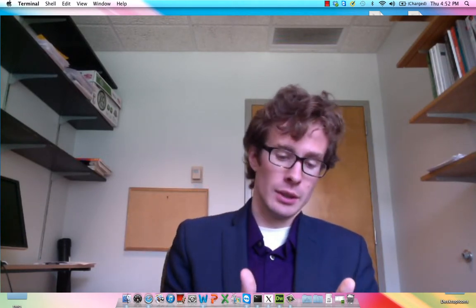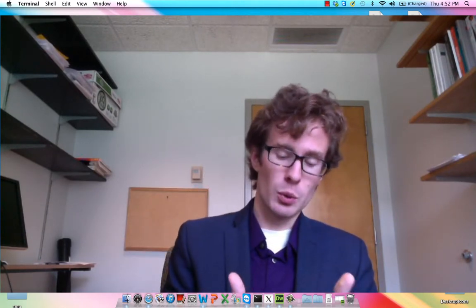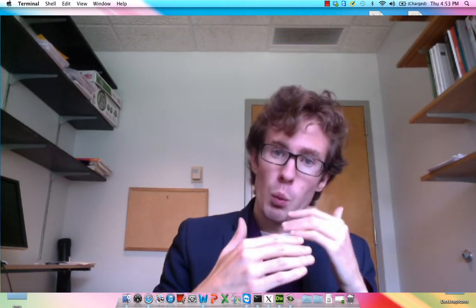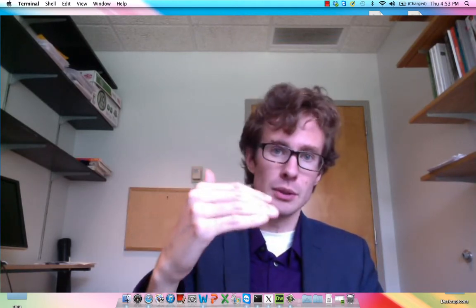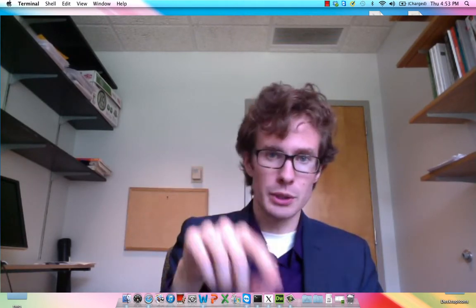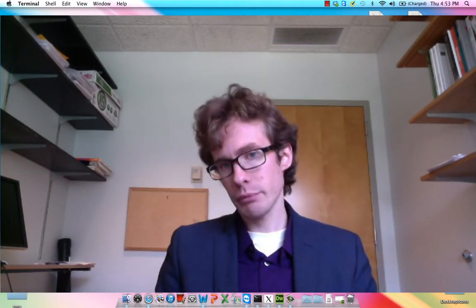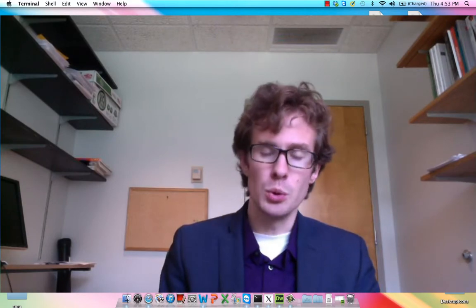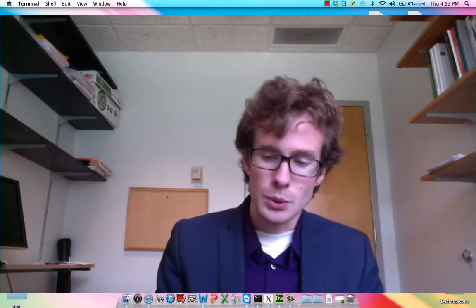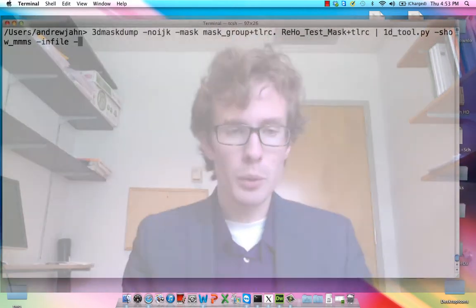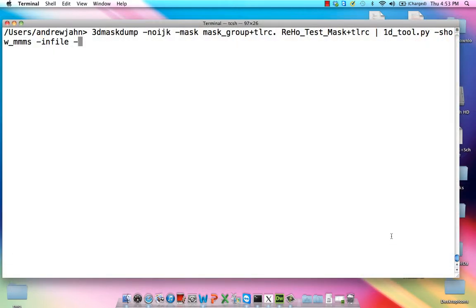1D meaning that it simply takes for input one column of numbers. Each row is a different number, and a 1D tool can process that. To do that, we're going to use a 3D tool, 3D mask dump, to extract each value from each voxel.